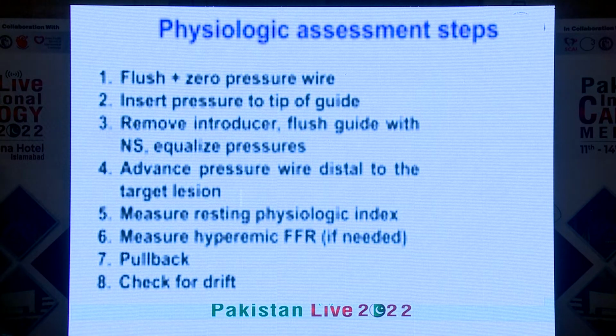Measure the resting physiologic index. Now iFR has made life really easy, and that's why the volume of this pressure wire has gone up tremendously because of that. And measure hyperemic FFR if needed. If you don't know, I'll still do it, but I just do intracoronary. Intravenous is a hassle to use.